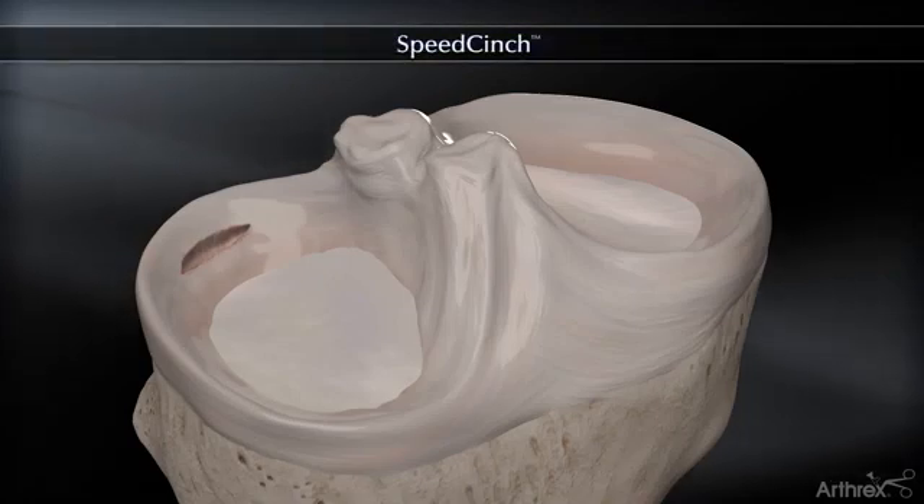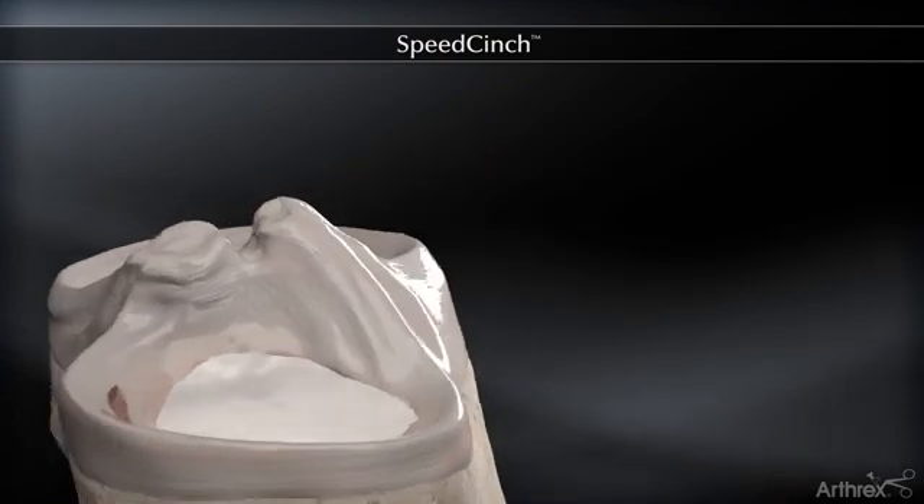The Speed Cinch brings all inside meniscal repair to a new level of simplicity, safety and speed.